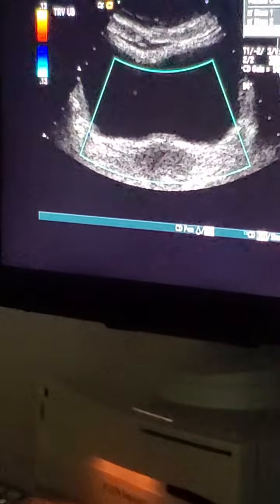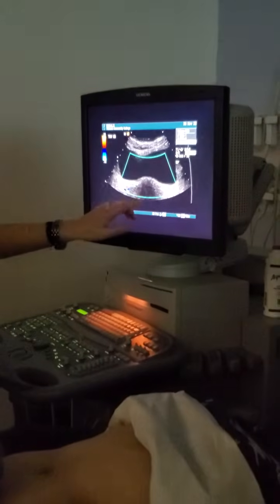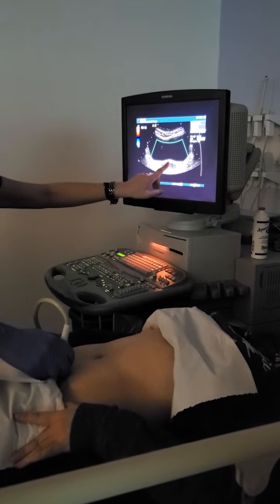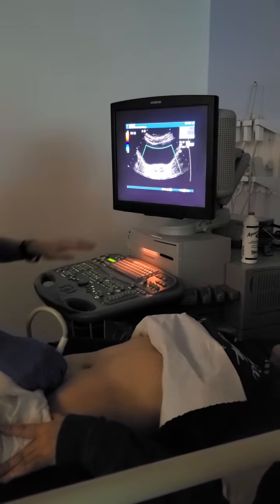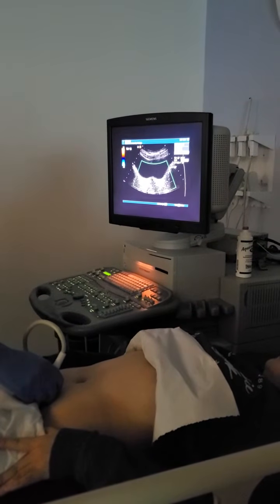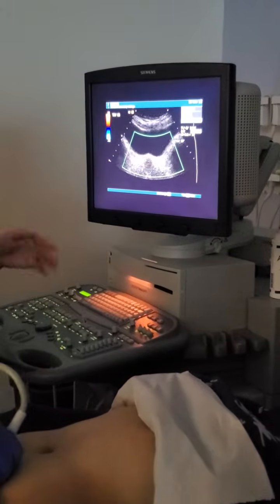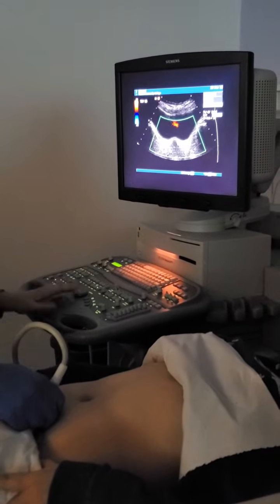And if we go down, so here let me start at the top. So I'm at the superior, and I'm angling down towards the inferior, and we'll see, especially with very full bladders, you'll see these subtle little bumps on the bottom of the bladder, and that's where our trigone's at. And so that's where we're going to be hunting around. I just sit on this for a few minutes, maybe do a very small sweep through. So there's one right there.